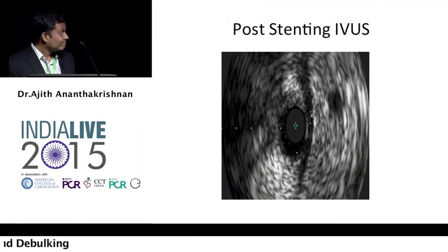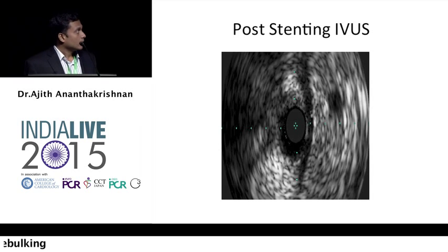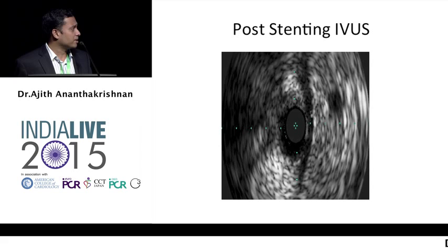Sorry, back. Can you play this movie? Post-stenting IVUS showed that there is significant lumen gain. That's the beauty of this imaging-guided ISR PCI. We saw that it was a 2.75 wall-hugging lumen. Now we see that it's significantly expanded.